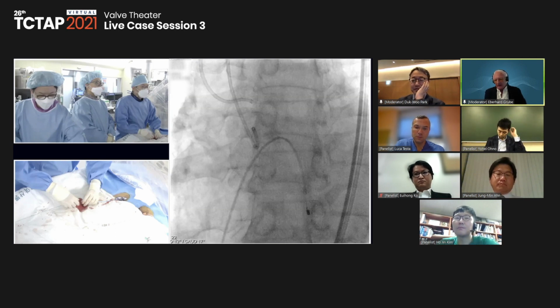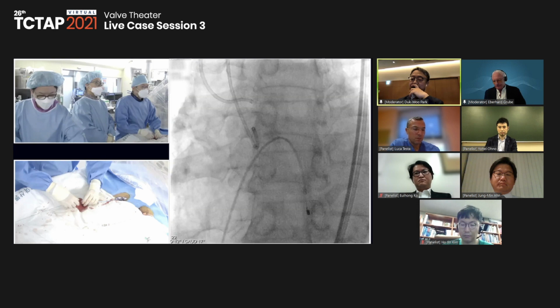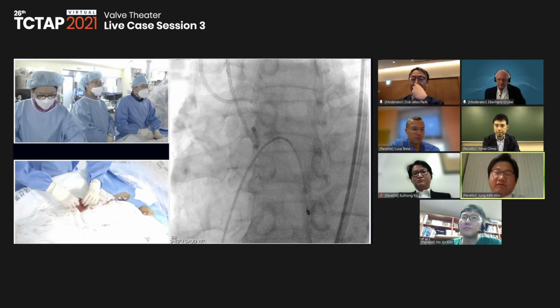And if you do an MRI, that's also, of course, possible, but it's just another major examination and quite costly. So we would probably go for both MRI and 3D echo. Okay, and any comment? I think the selection of a self-expandable device would be a good option, because there is the size ambiguity in the sizing. So a self-expandable device would be safer than the balloon expandable device.